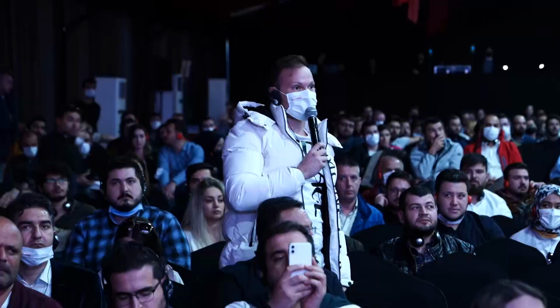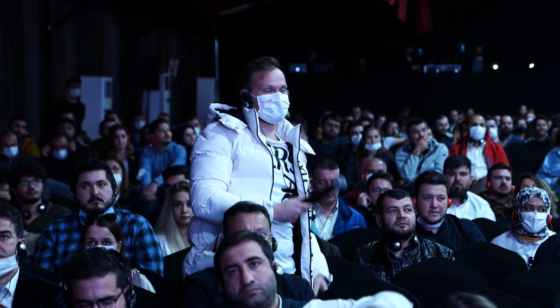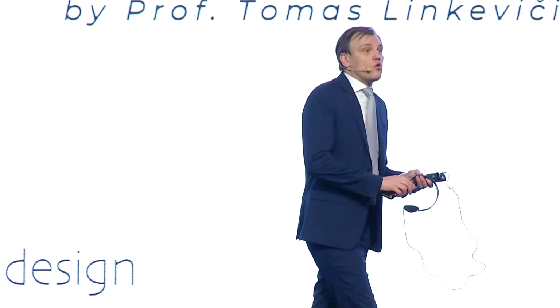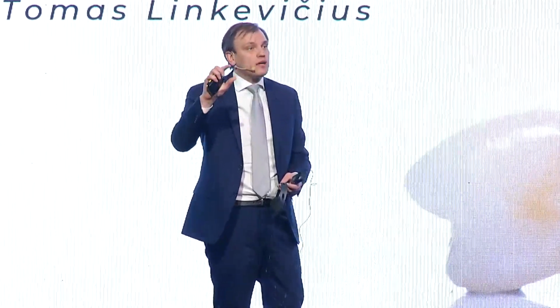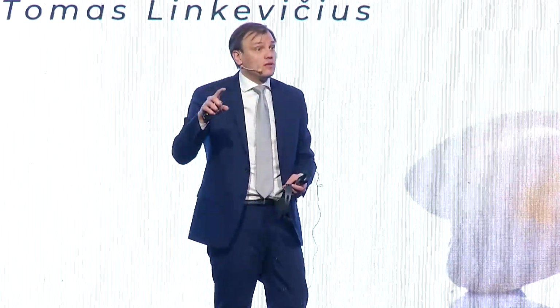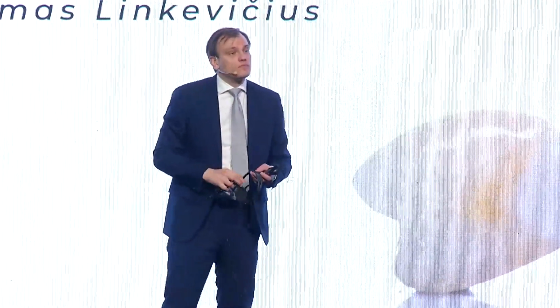How can we use zirconia crown on the all-on-6? The same way, all-on-6. So with zirconia, you have the framework, which is polished, and you even have the polished part in interproximal spaces, with pontics as well. That's the way to use it, because for implant protection, the implant part is important. But it can be broken.